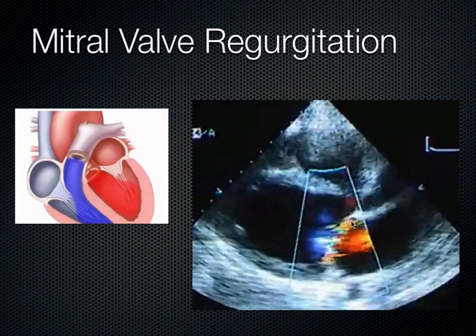One of the things you've got to remember about Doppler, it's a little bit confusing initially, but you've got to kind of commit this to memory, is that when you work with Doppler, you can't have the Doppler assessment at 90 degrees to the angle of the sound. In other words, this is the parasternal long axis of the heart. Here's the left atrium, mitral valve, left ventricle, aortic outflow tract, right ventricle. The mitral valve is exactly 90 degrees. It's perpendicular to where the probe is, and the flow is moving at a 90-degree angle. So this is the incorrect way to try to assess the mitral valve when using color.